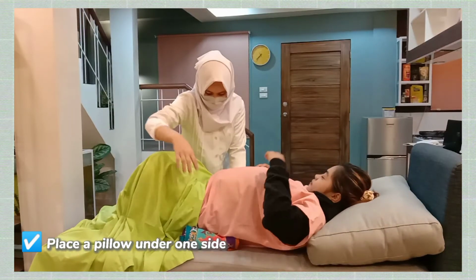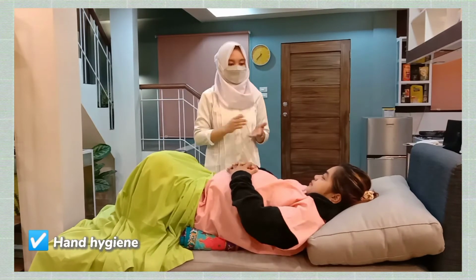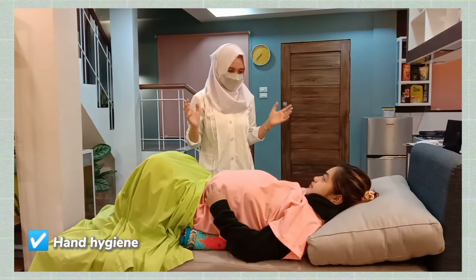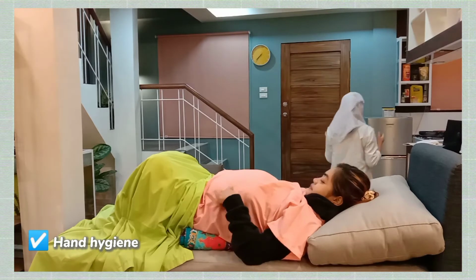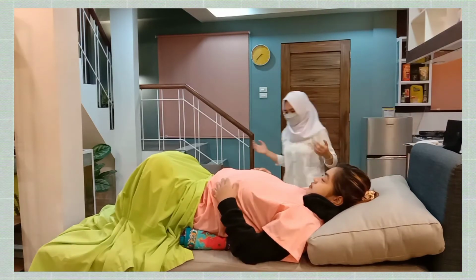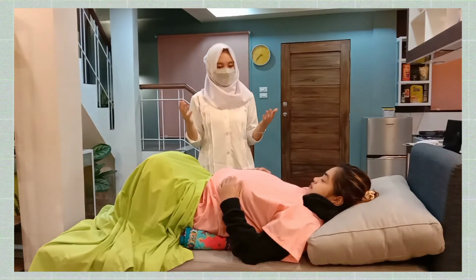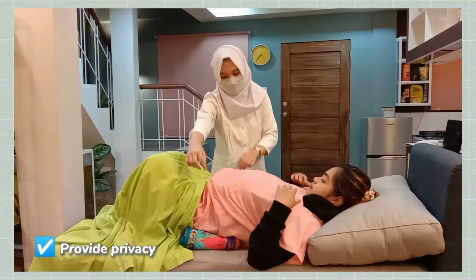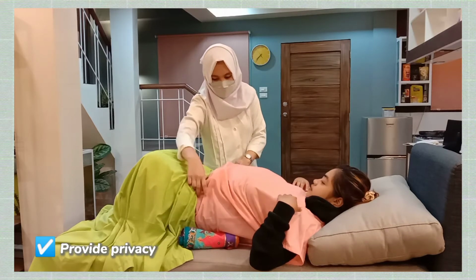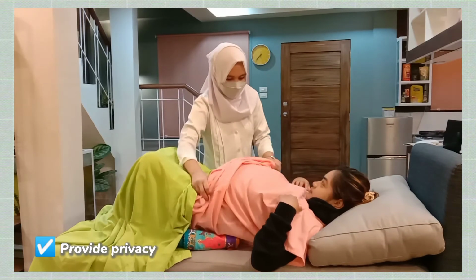Now, before we start, let me wash my hands again with warm water to prevent spreading of microorganisms and infection. Wait for a while po, ma'am. Now that I have washed my hands already, let me pull up your shirt po, ma'am. Don't worry, because I'll be only exposing your abdomen and I ensure 100% privacy, because all the data that will be gathered today is safe and confidential.